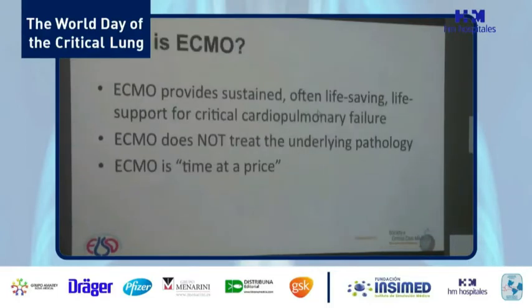It provides a sustained, often life-saving, extended cardiopulmonary bypass for both cardiac or pulmonary failure. It's important to note that ECMO itself does not treat the underlying pathology. What it really does, by giving support, is provide time at a price. You are able to give additional cardiorespiratory support, but for every hour you continue on support, you risk complications of the technique.